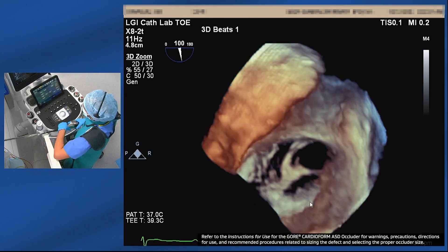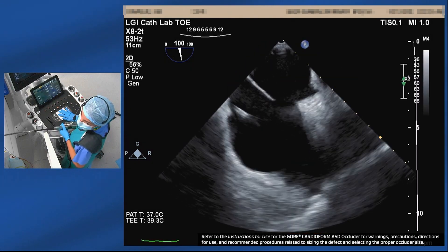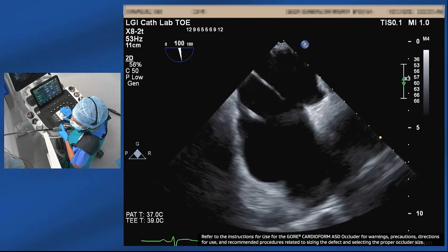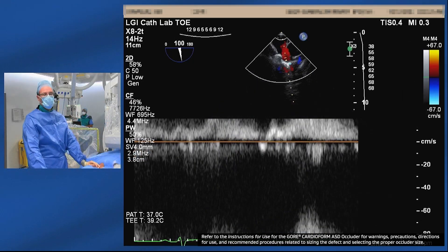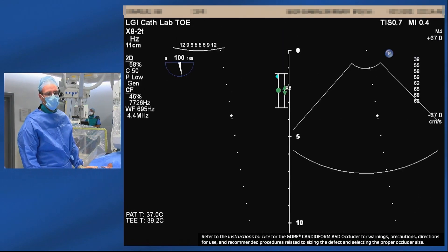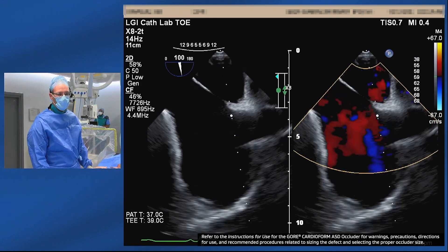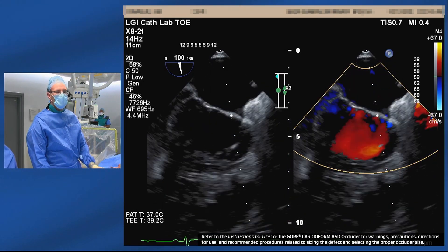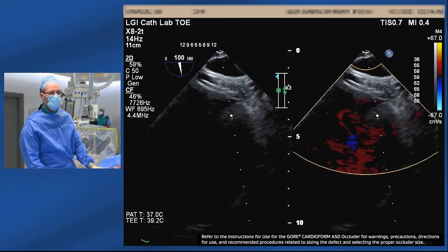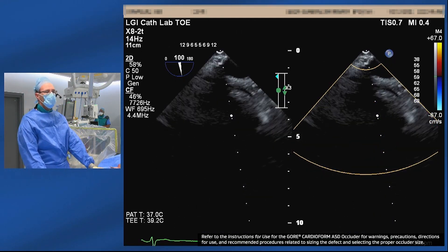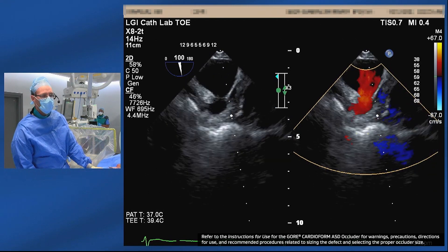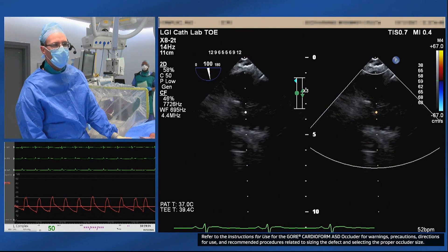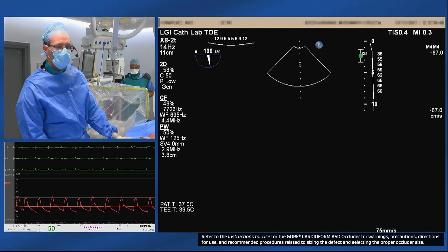So a nice sized defect with good rims, slightly smaller and just a little thin towards the inferior rim. We'll balloon size to check that we get similar dimensions, but probably plan on placing a 37 if the balloon sizing concurs. The pulmonary artery pressure waveform has a mean of 30; left atrial mean was 12. But there is a 2-to-1 shunt on MRI, so we will proceed with closure.